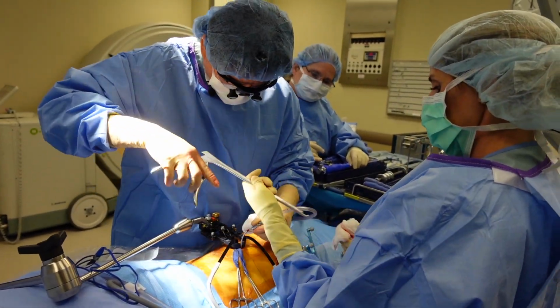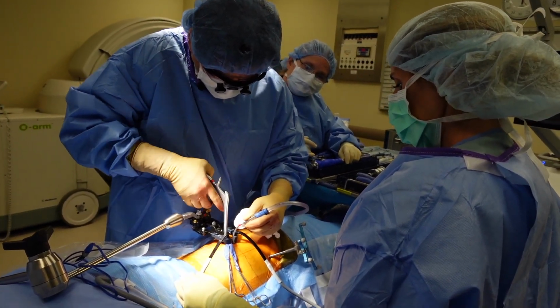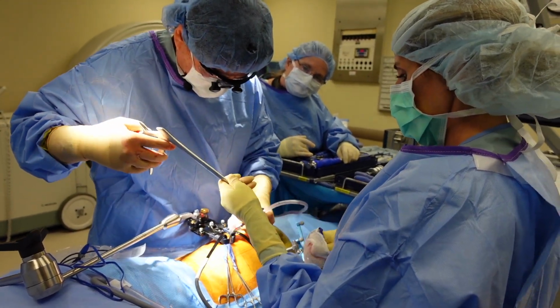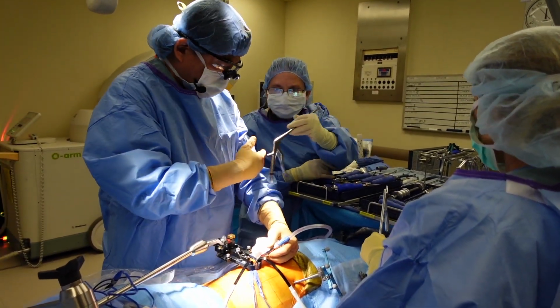In traditional open surgery, the surgical corridor is like a funnel with the opening really big, then narrowing down to the surgical target site and blasting everything along the way. Regular retractor. And we abhor that kind of surgery, but don't tell anybody else that.